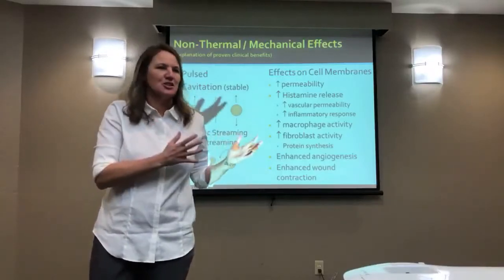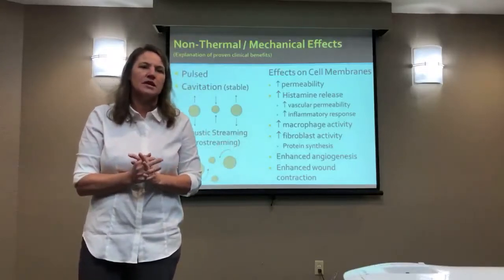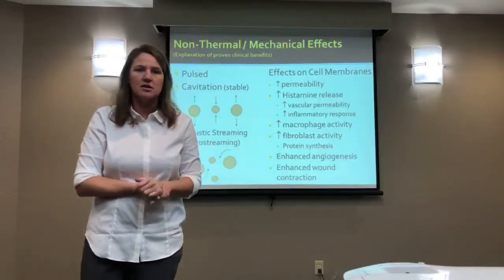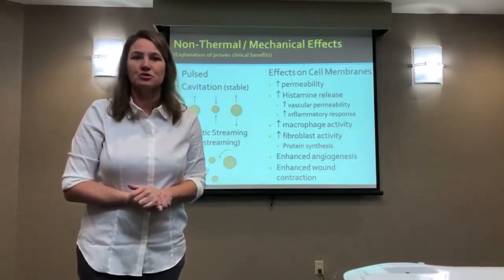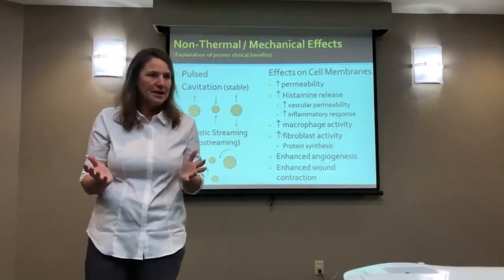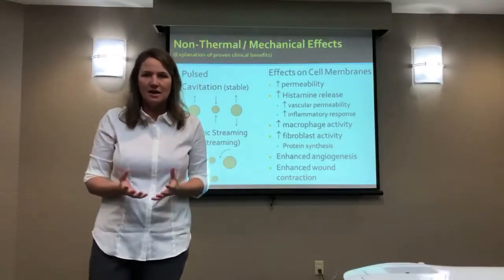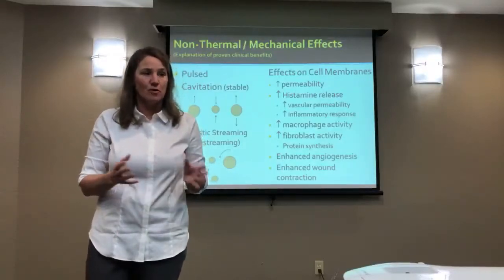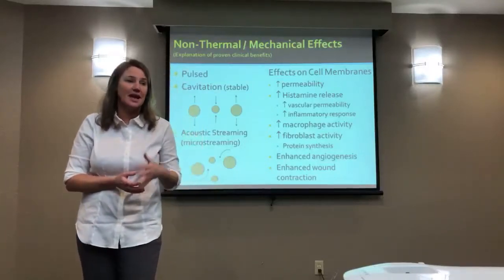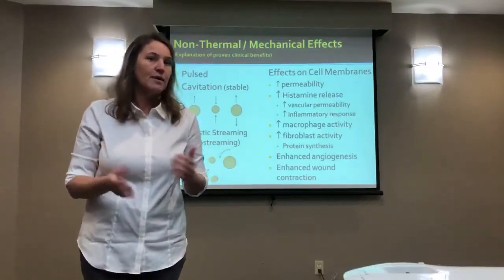So basically realize that even at a 20% duty cycle, yes, on vascular tissues, human tissue that has blood flowing through it, it's not likely to cause a heat rise, but all tissue is not created equal. For example, around a black toe, if somebody has severe arterial damage, ultrasound is not a modality that you should be putting on in any form, simply because the blood flow is so impaired, you can't predict how evenly that energy is going to be distributed and if they can dissipate it well. So again, think about your precautions that way.